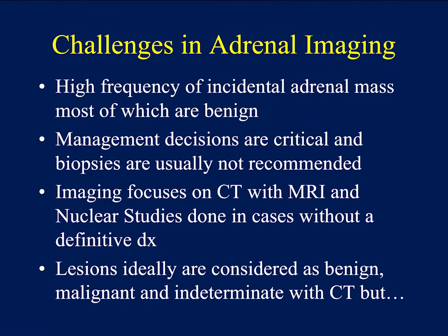Now, the challenges in adrenal imaging are far more than saying, oh, look, there's an incidental adrenal lesion, which may occur in 10% of patients over age 50 or 60. We know most adrenal lesions are going to be benign, incidental, non-functioning adenomas, but not every lesion. Management decisions are critical, but biopsy is not recommended. We can do follow-up, but you want to follow up select cases, not every case. Imaging focuses on CT, but MR and nuclear medicine can be helpful in select cases.